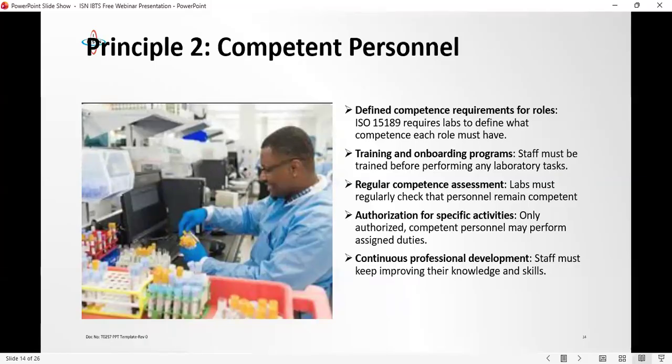Because of the difference in sample per manufacturer, because they have done statistical analysis on their instruments and reagent requirements, it may require that you change your collection procedure. Even for hormonal assays, for labs that perform hormones, you need to have a training, especially for onboarding a new instrument or new method, or you buy a new kit. You need to be consistently vigilant, because lithium heparin and citrates, some instruments use lithium heparin for D-dimer and some use only citrates. If you interchange, it may affect the quality of results that are produced.